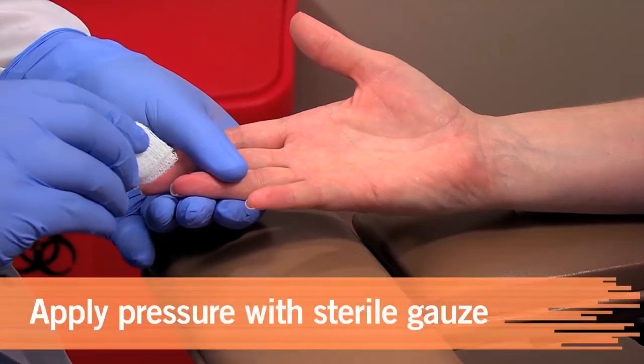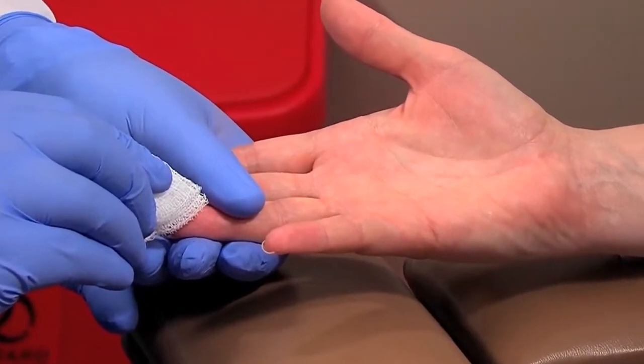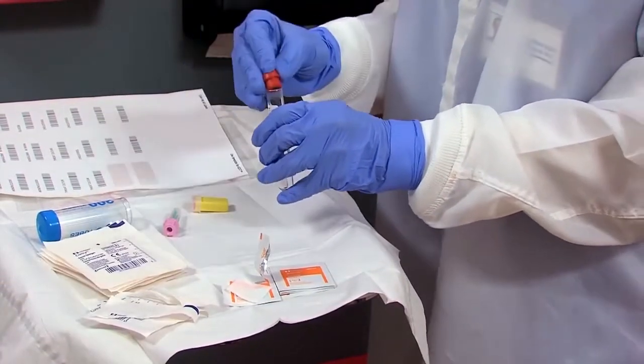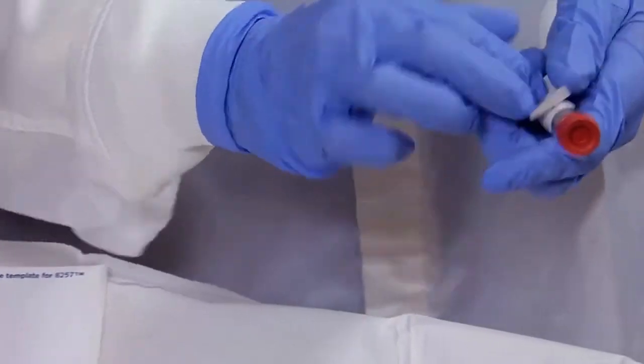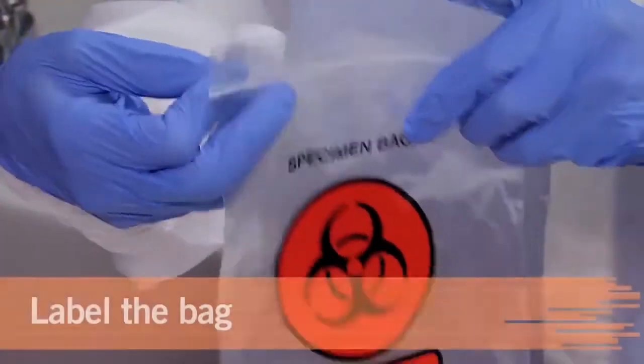When collection is complete, apply pressure to the puncture site. The patient may be able to help with this step. Be sure to label the containers. Sealed capillary tubes can be placed in a red-topped tube, which is then labeled. The microtainers can be placed in a zipper lock biohazard bag that is then labeled.